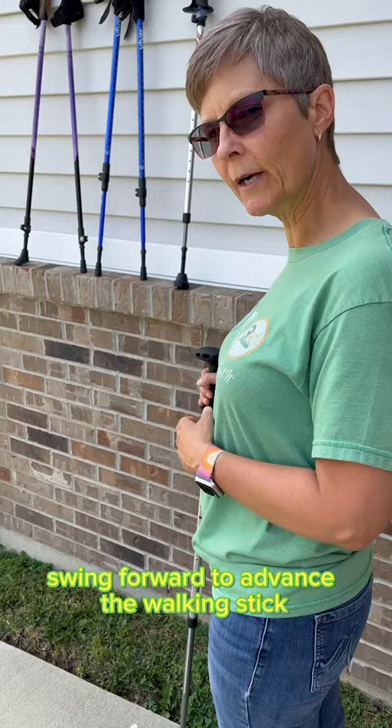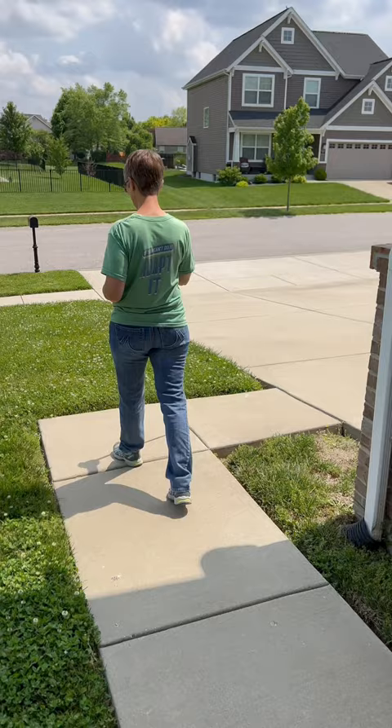So you're going to step and advance just like this. And that's how you use a walking stick in place of a cane.